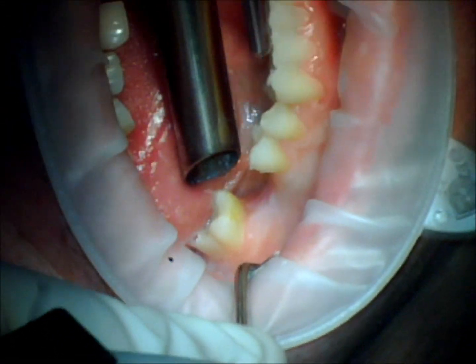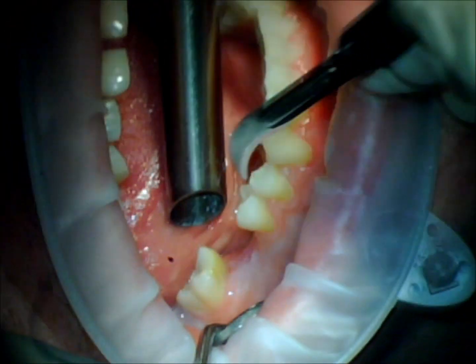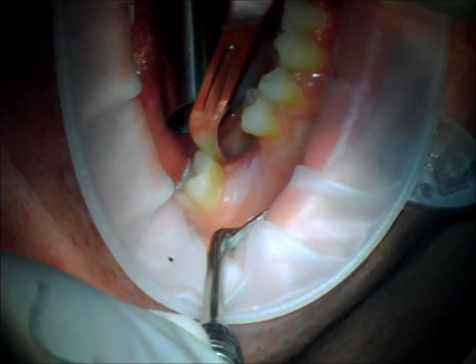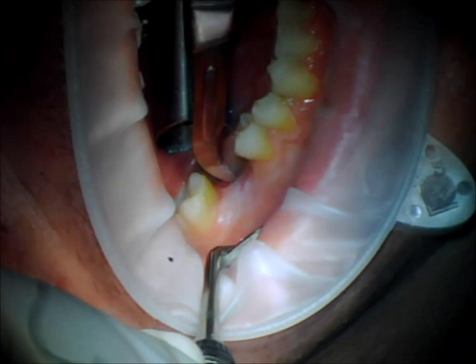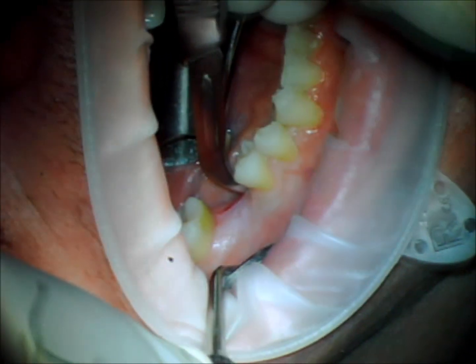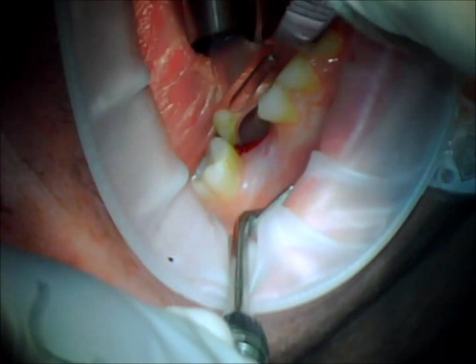We're doing an implant on number 30 today. This is a tooth that we extracted a few months back, but it had a severe infection at the time. Since it was right on top of the nerve, we did not do a bone graft. At least on the cone beam the bone looks really immature, but I really expect it to be good quality when we get in there.